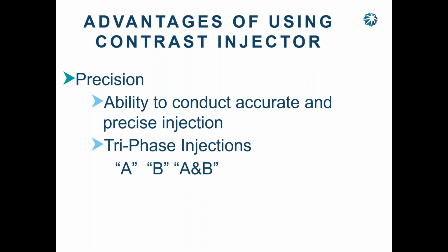The doctor requests a 50 and a 50, so it's 50% contrast, 50% saline. What's that going to do to the image? It's going to be a different shade of gray, not like the movie, okay? But you can develop different shades of gray to give you better viewing, better imaging of what exactly you're looking for. You may not want that vein or artery completely darked out.